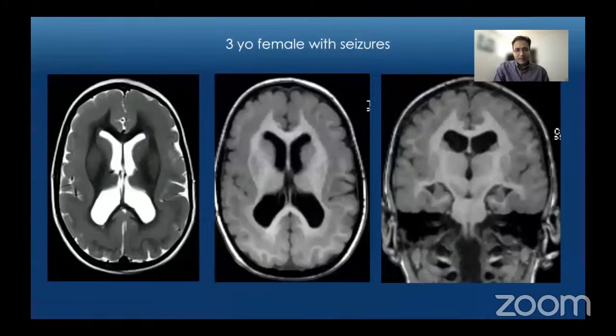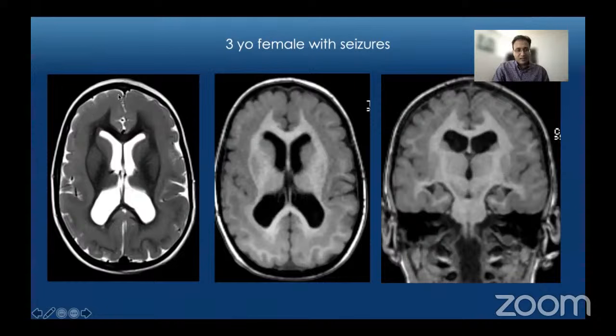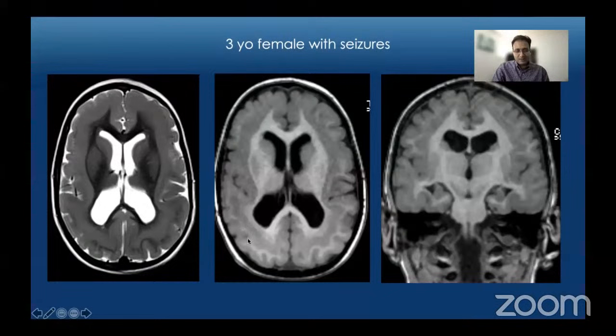Case number four: a three-year-old female presenting with seizures. On axial T2 and T1-weighted images we see an abnormal gyral and sulcal pattern with broadening of the gyri, very shallow sulci, and associated cortical thickening. In the posterior region there is a band of white matter separating somewhat normal-appearing cortex from an additional band of gray matter. This is seen better on T1-weighted images: relatively normal cortex posteriorly, a band of white matter, then another band of gray matter — anteriorly it looks more like diffuse cortical thickening.